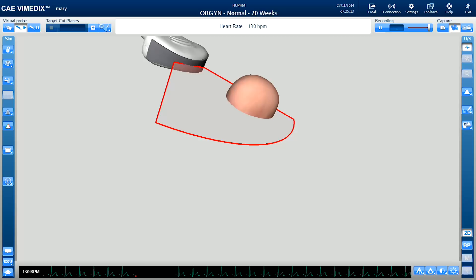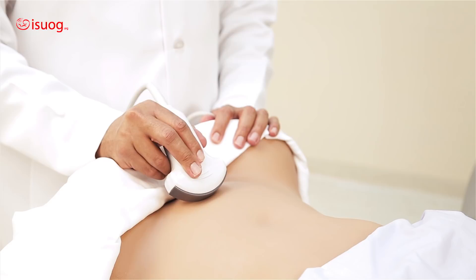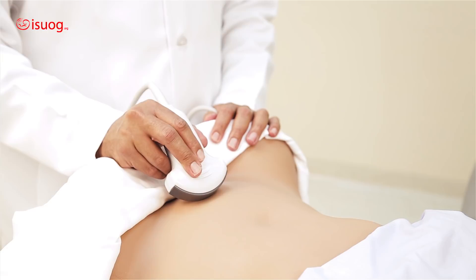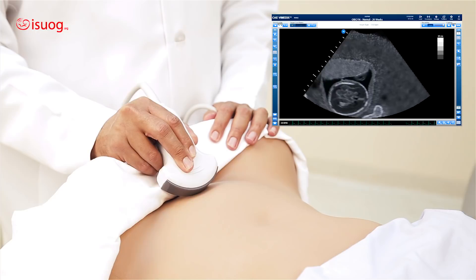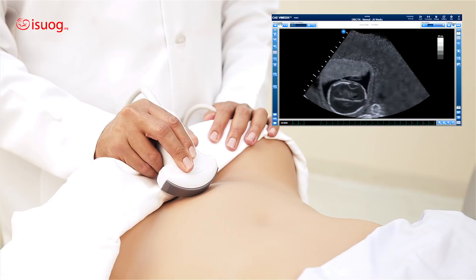I'm going to demonstrate how to use angling in your ultrasound examination. One example is when you are trying to get the biparietal diameter. In the image on the screen, I am trying to get the biparietal diameter, but because the biparietal diameters are not on the same level, I could never get the falx in the middle. So what I need to do is angle. But as you can see, once I am angling, I am off my focus.